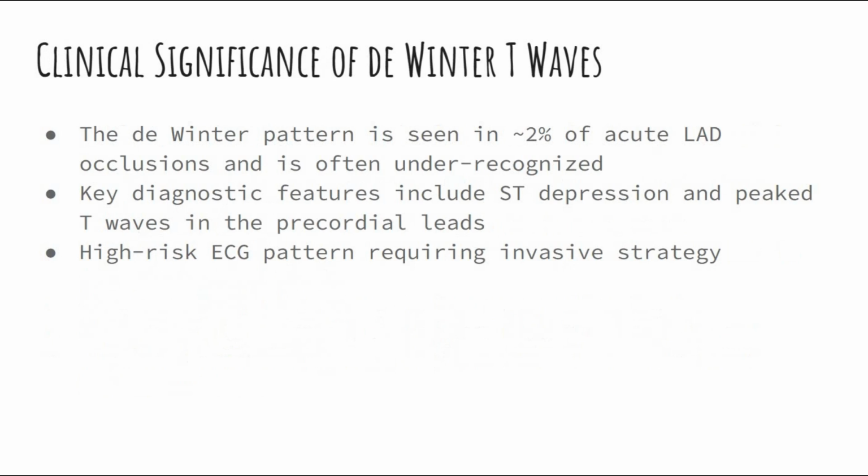Why is the De Winter T-wave important? It's observed in approximately 2% of acute left anterior descending artery, or LAD, occlusions. Unfortunately, it's often under-recognized, which can delay life-saving treatment. This high-risk ECG pattern highlights the need for urgent intervention, often involving invasive strategies like PCI or thrombolysis.